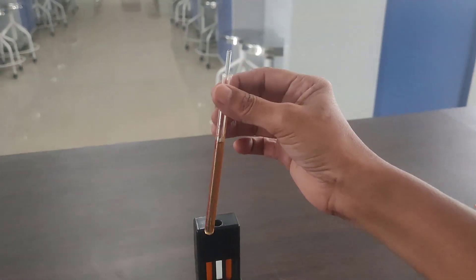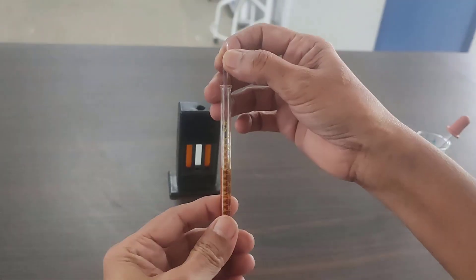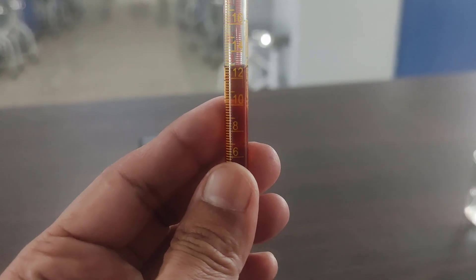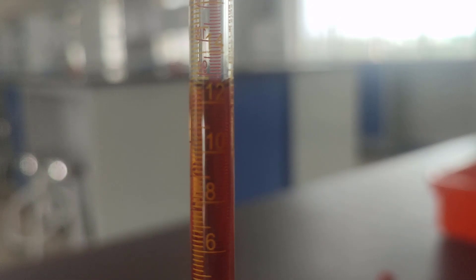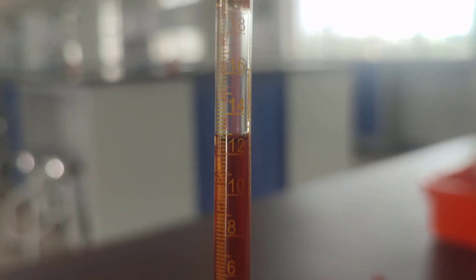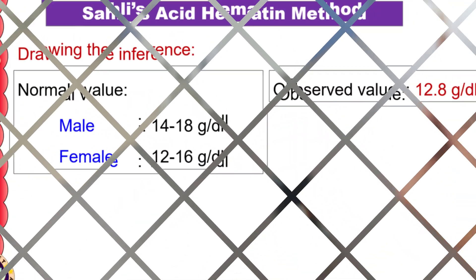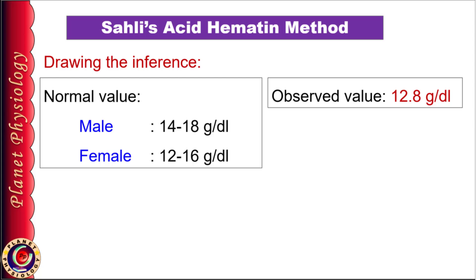Once the color matches exactly with the standard, take out the hemoglobin tube, lift the stirrer above the solution, and read the gram percent on the yellow scale. Note the reading where the lower meniscus of the solution corresponds to the scale, and record this value as the hemoglobin content in the blood. If you are not sure whether the color is exactly matched, note the reading and add one more drop of distilled water, mix, and match the color again. If it is perfectly matching, record that value; but if the color is lighter, take the previous reading as your hemoglobin content. In this case, the hemoglobin content is 12.8 gram per deciliter.